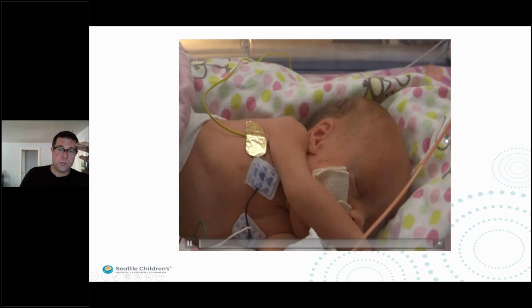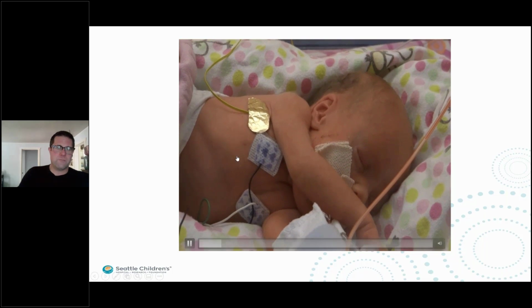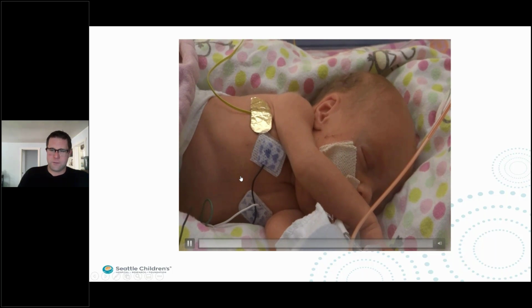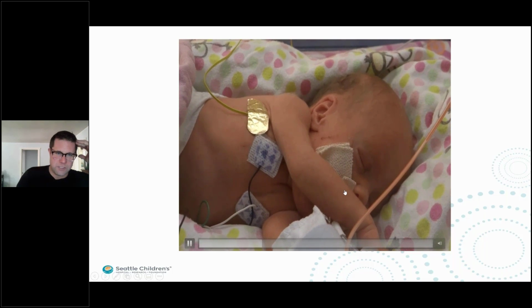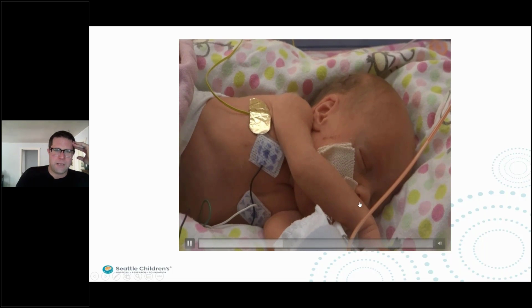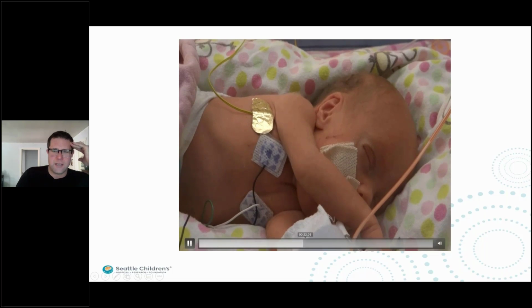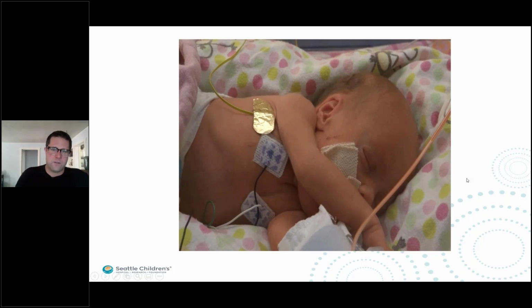This is a patient who looks pretty good, and every time they trigger a breath, they get that breath immediately. These ventilators, especially when you use the proximal flow sensors, are super fast and super responsive. It doesn't matter which one you're using. They all should be able to respond to these very sensitive changes in pressure in the lung that result in a change in flow, which allow these children to actually trigger the mechanical ventilator.